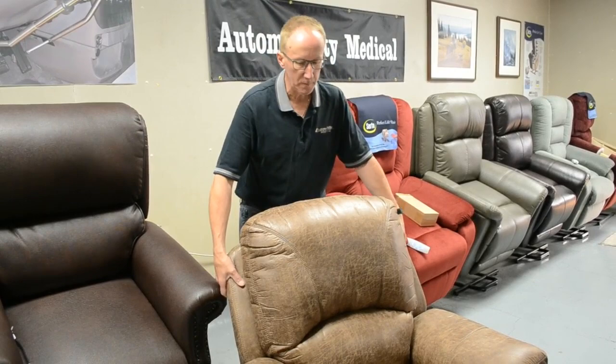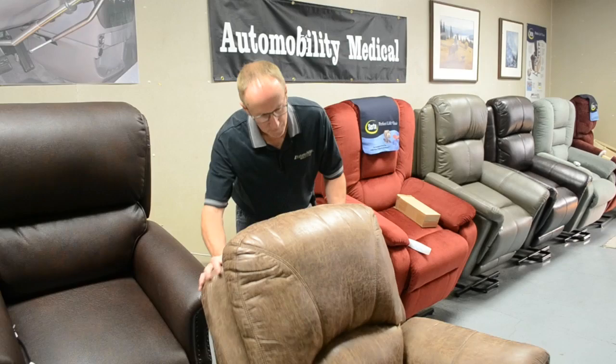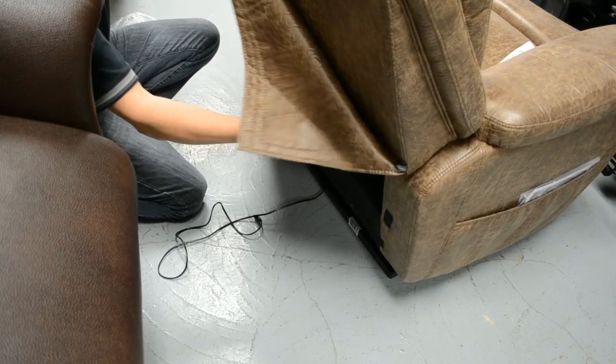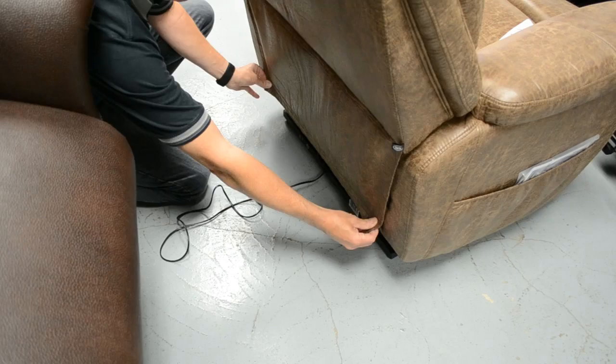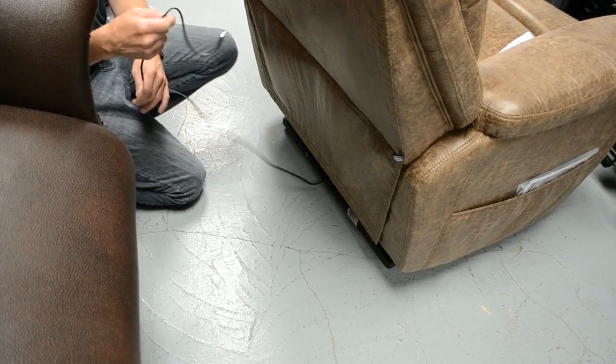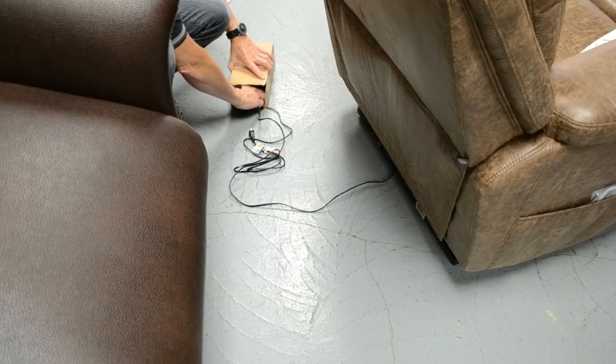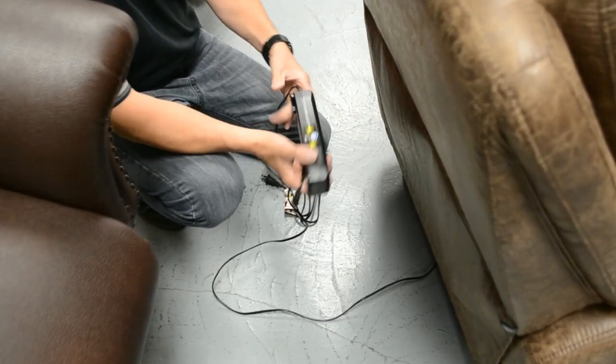Also on the back they all have a flap just to close this off and make it look pretty. So if you've already connected the pendant you can close this off — just bring it down; it's velcroed to the back so you don't have to do anything else. And then this is your power cord which now goes to the transformer.